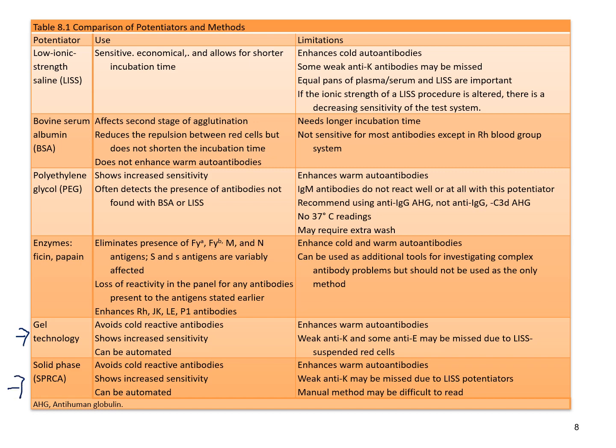And with your gel and your solid phase, they have been shown to increase or enhance some of those warm autoantibodies, and so that is one of those things that has become a little bit troublesome when you have those warm autoantibodies present, because it's going to interfere with that particular test methodology. However, there are ways to clean that up a little bit.